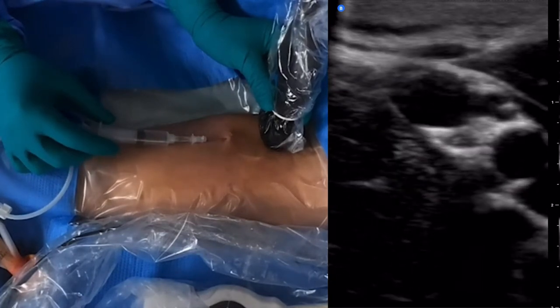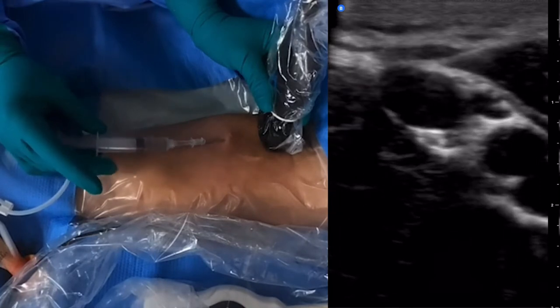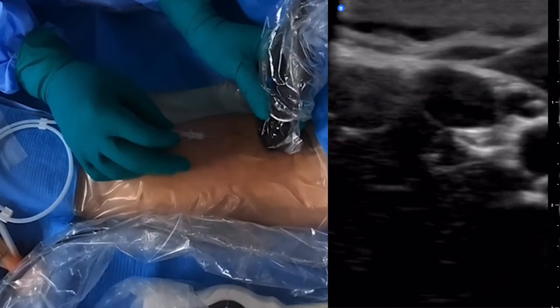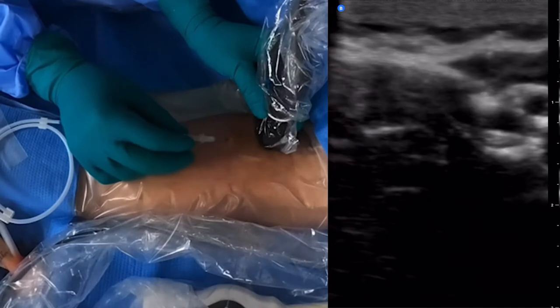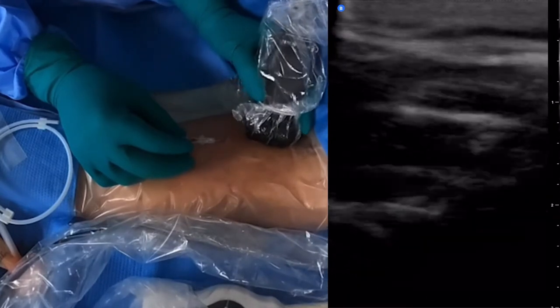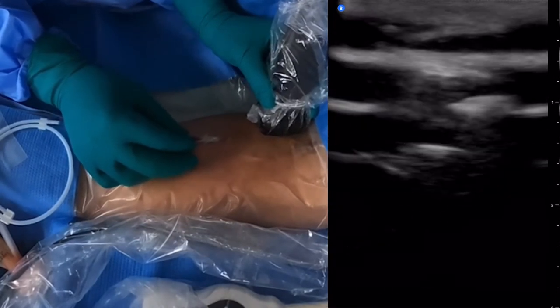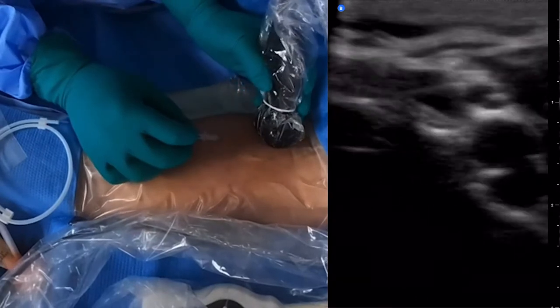Nice subdermal wheal. When you're doing this, make sure not to advance with the plunger — advance with the syringe itself. If you're uncomfortable with that, remember: the fluid and the medication is not going to inject if you don't push the plunger. It stays in place. But I want to see that flashback really fast. Can you feel this? Nope. About this? Tiny bit — not a lot though. There's my needle. I'm going to continue to advance — I like to give it about a centimeter or two in the vein.